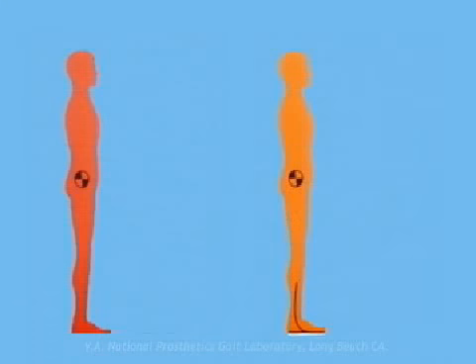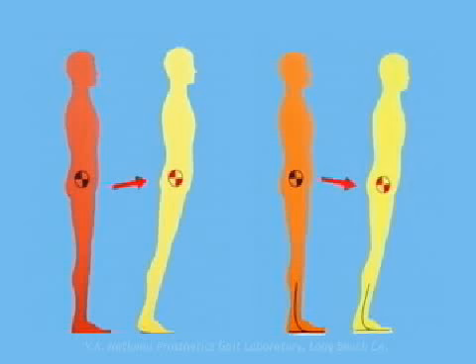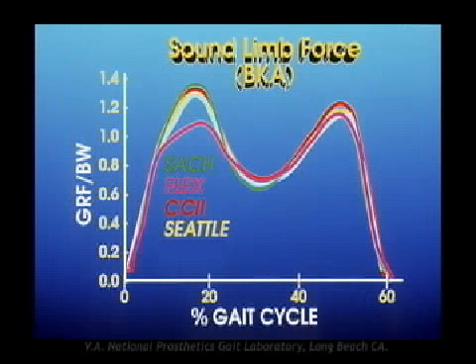Foot and ankle designs, which are more rigid, elevate the center of mass in terminal stance and pre-swing more than bladed-style prosthetic feet. The flexible blade pylon allows the center of gravity to sink slightly. This lowered center of mass results in a decrease in the vertical force in the sound limb seen in the bladed-style prosthetic feet when compared to various other foot designs.